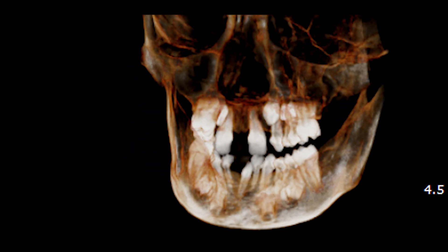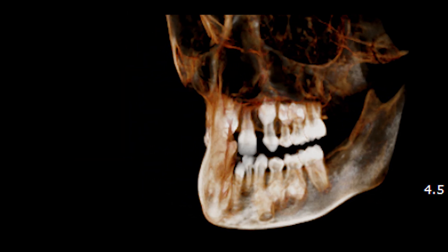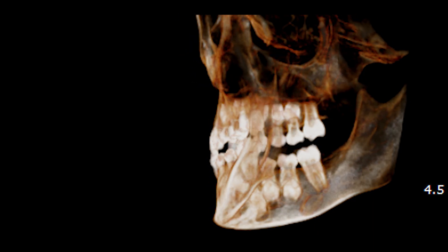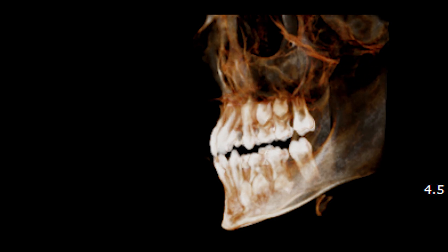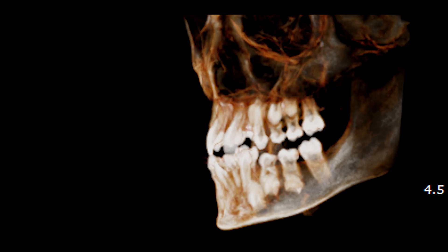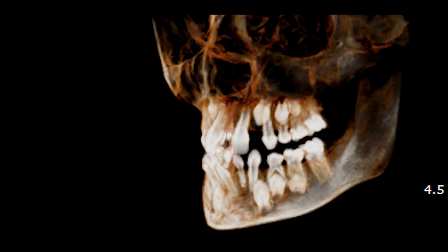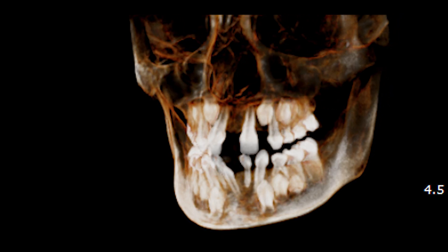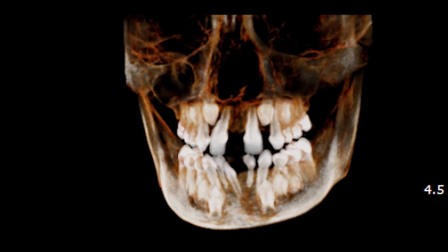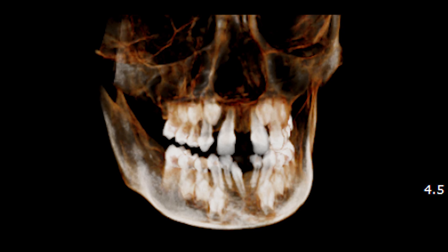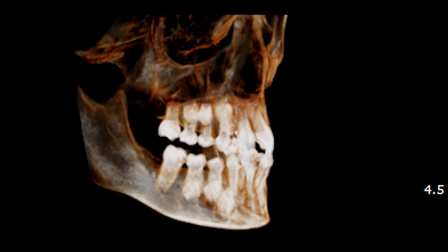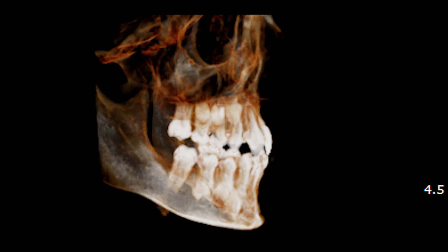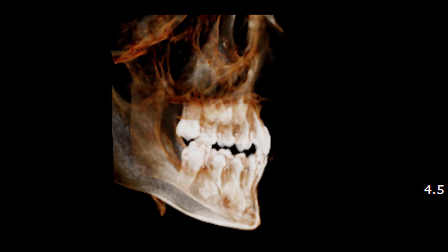Here is an example of a CBCT scan of a patient with ectodermal dysplasia. This 3D rendering shows multiple missing teeth of both jaws. Thank you very much, and I'll see you again in a different video.